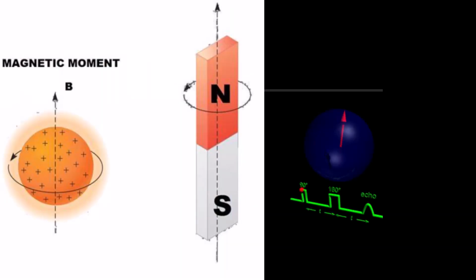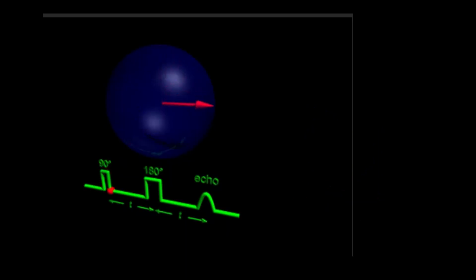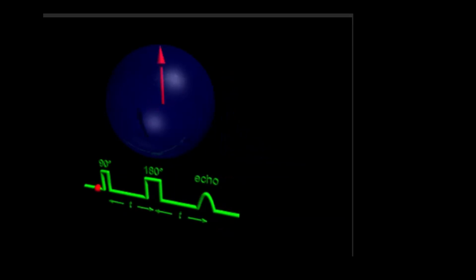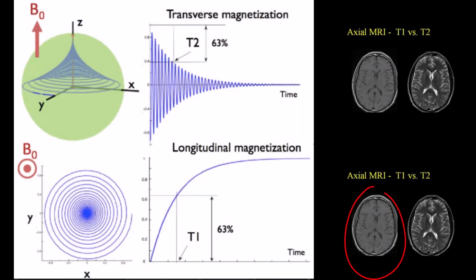The movement of protons to the south by adding energy and then aligning the protons back to the north is called a spin echo. As we map the energy release, we map it over time, and this is called T1 and T2. So we know exactly what energy is where at what specific time. T1 is tissue weighted and T2 is fluid weighted.